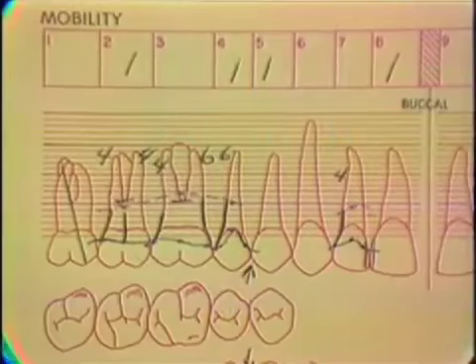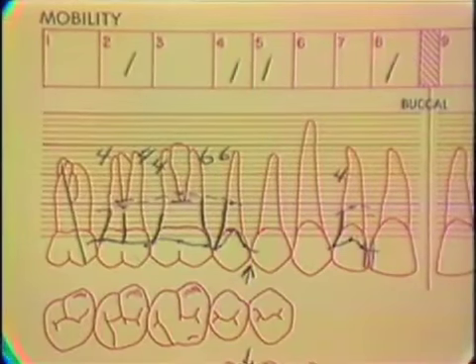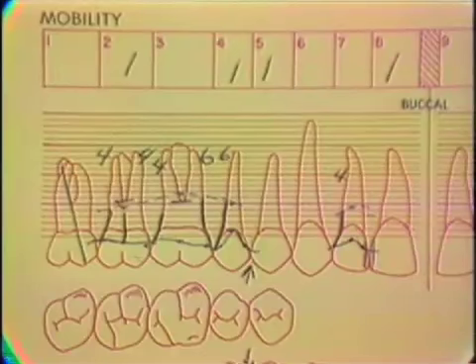And now that the chart is complete, please compare your chart with ours.